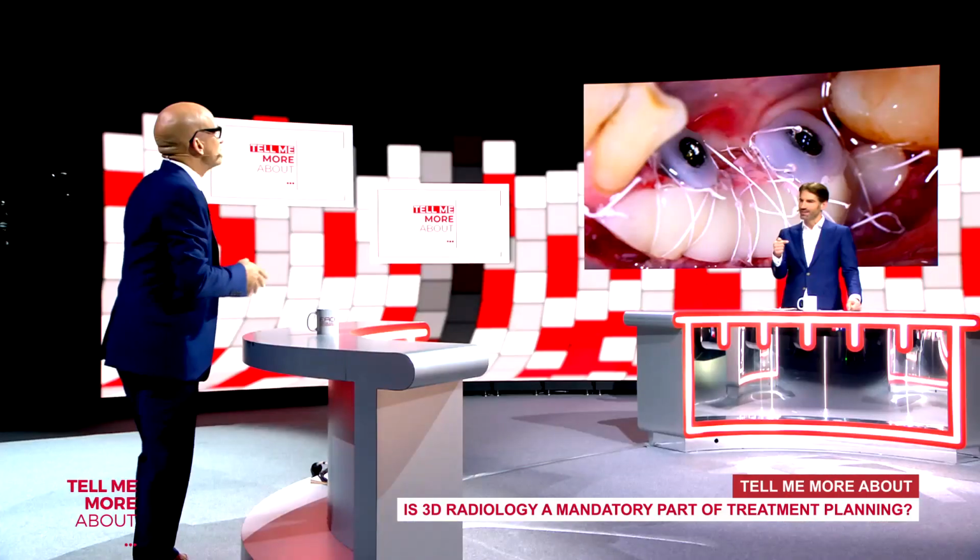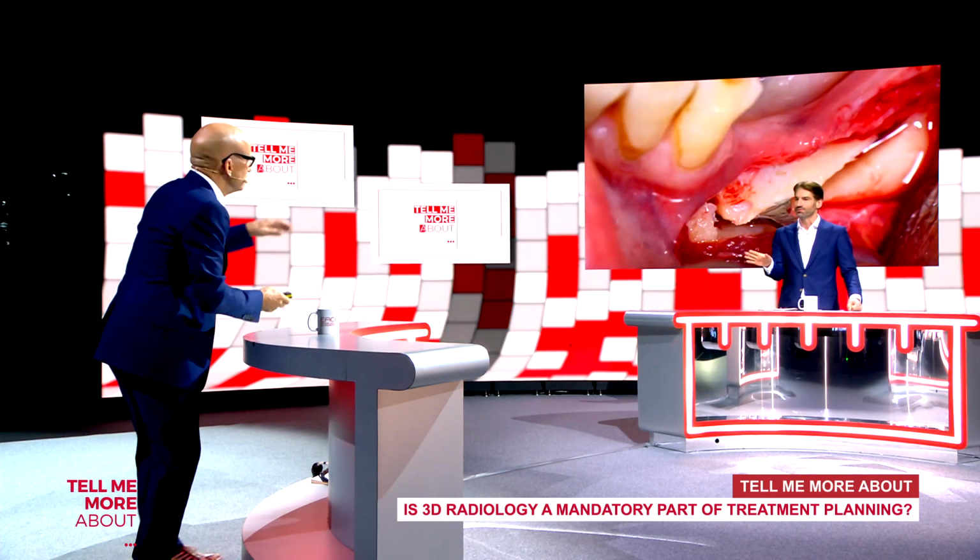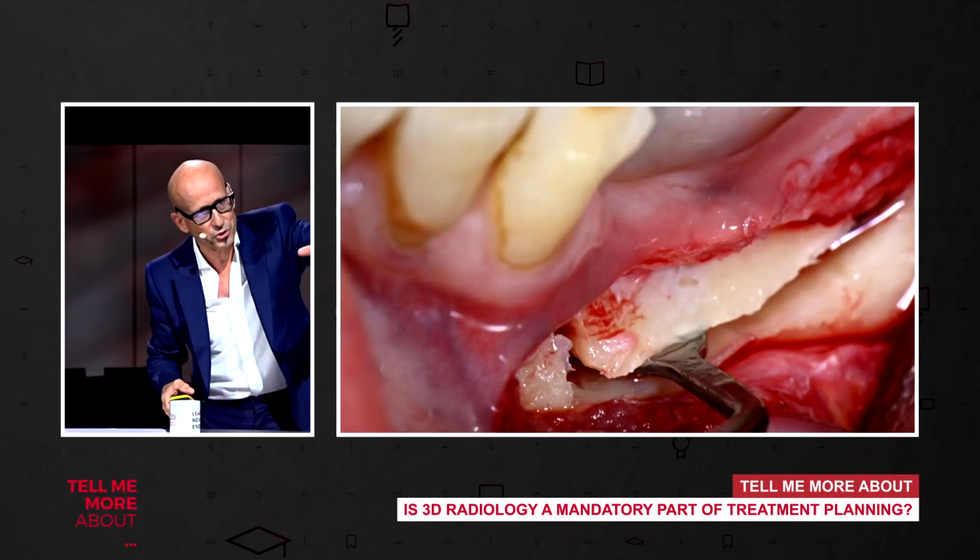In this case, were these the horizontally placed implants that you now take in the second session? No, that was a different concept. Yeah, this is the surgery when we augment the bone.